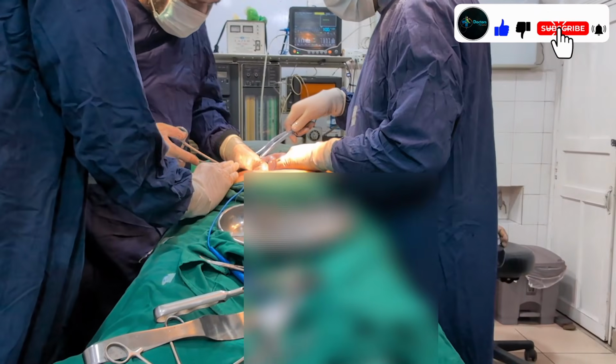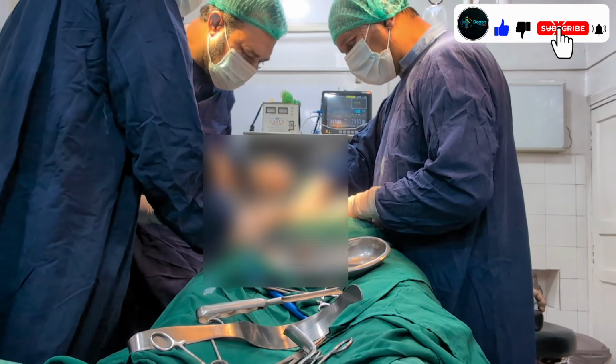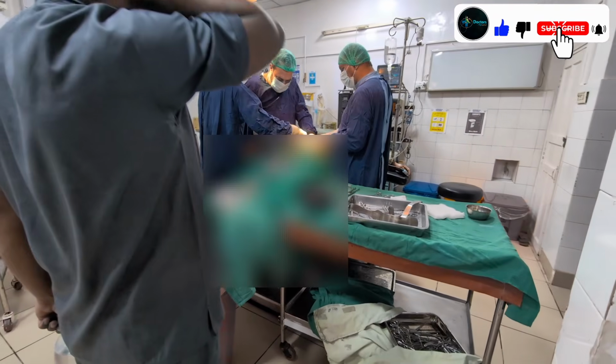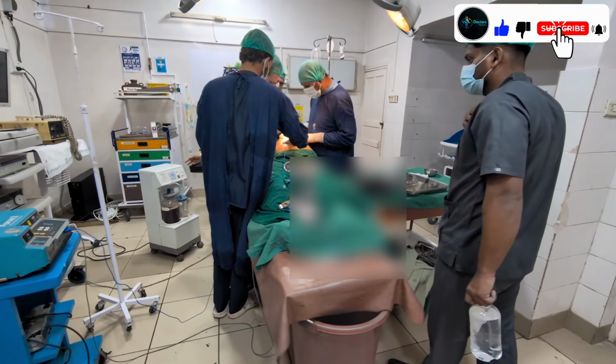This cyst has now been successfully removed. As you can see, the closing of the patient has started. The surgeon is taking full care to avoid any complication and ensure a smooth recovery.